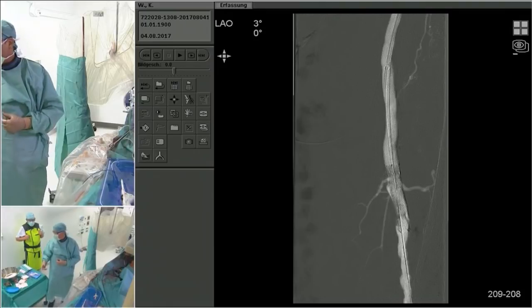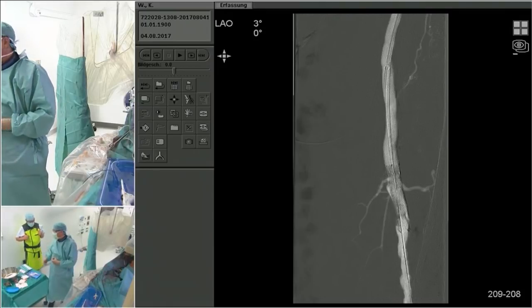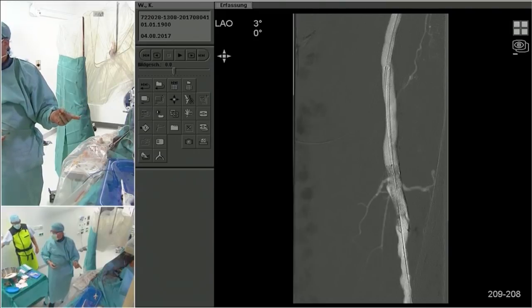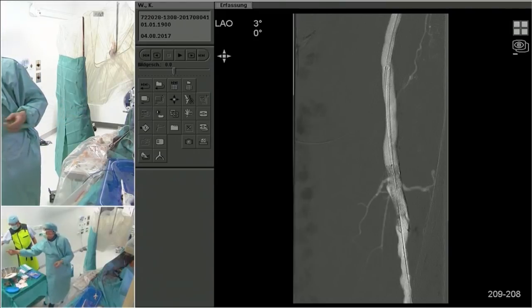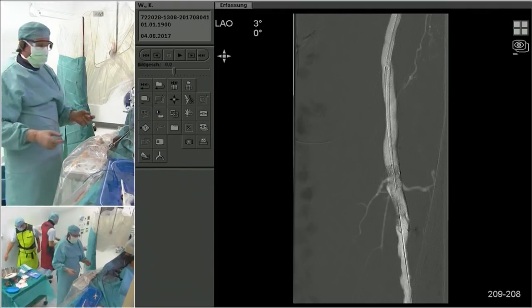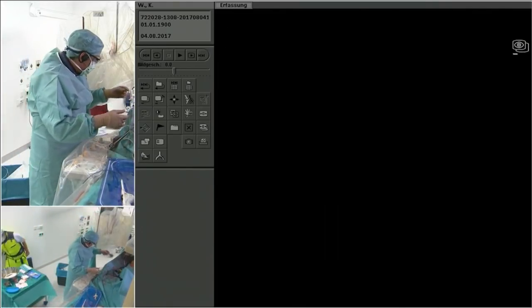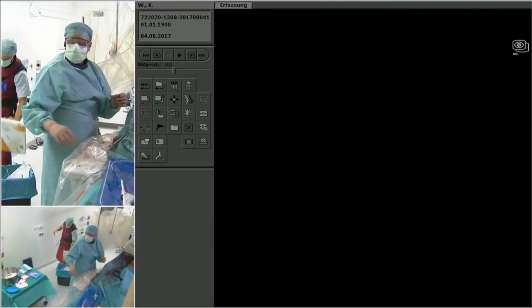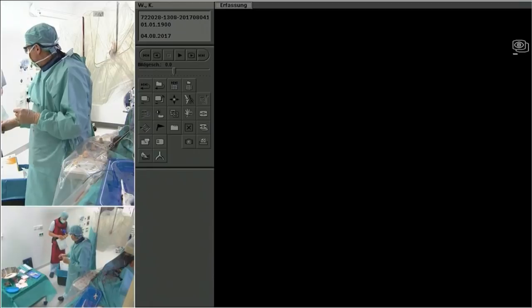Are they going to address the popliteal? Yes. I think they have the popliteal, I will balloon now with a drug-coated balloon. Ready? This is a beautiful demonstration. We applaud your great action, and we are ready here to move to the next room whenever you are ready to transmit. Thank you very much. Thank you, Ismail. That was a great case.